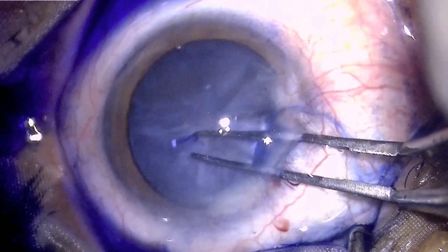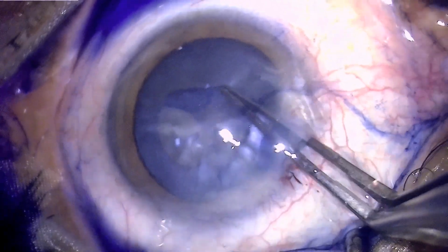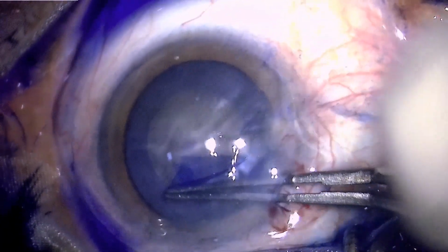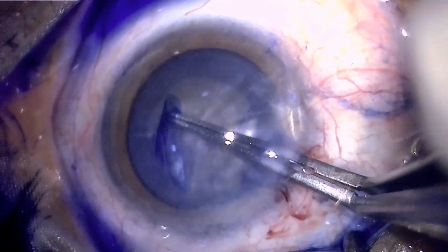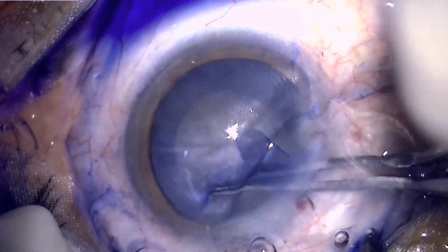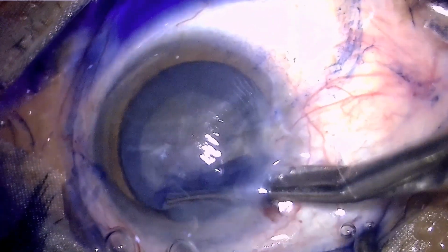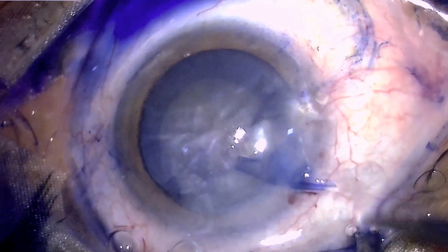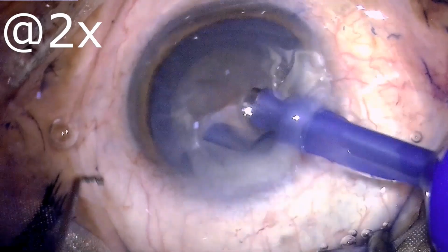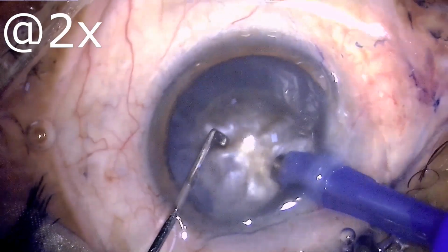This is the point where I have already made an opening in the capsule and am proceeding for capsulorhexis after staining the capsule with trypan blue dye. This was a slightly turgid lens, and hence the rhexis spiraled out. And then it was again an issue because phaco is not safe in such a situation. So this was a point where I had to think whether I should proceed with phaco or switch to manual small incision cataract surgery, which might have been safer.